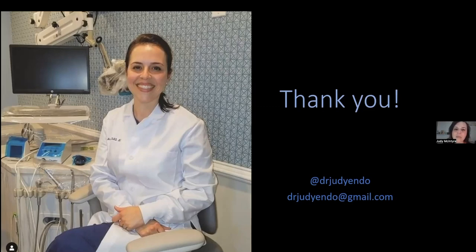Okay, next, how often do your hygienists take periodic PAs on crown teeth? Is it only when there's a complaint? Yeah, so I love this question because I actually wrote an article about this. I find this fascinating. I think I spent probably too much time encouraging everyone, when they're replacing large restorations, to take a PA beforehand.